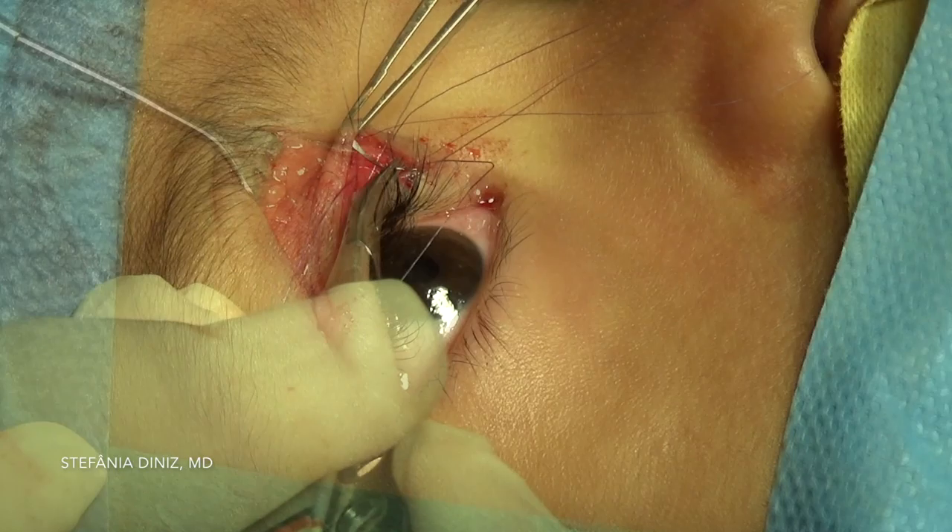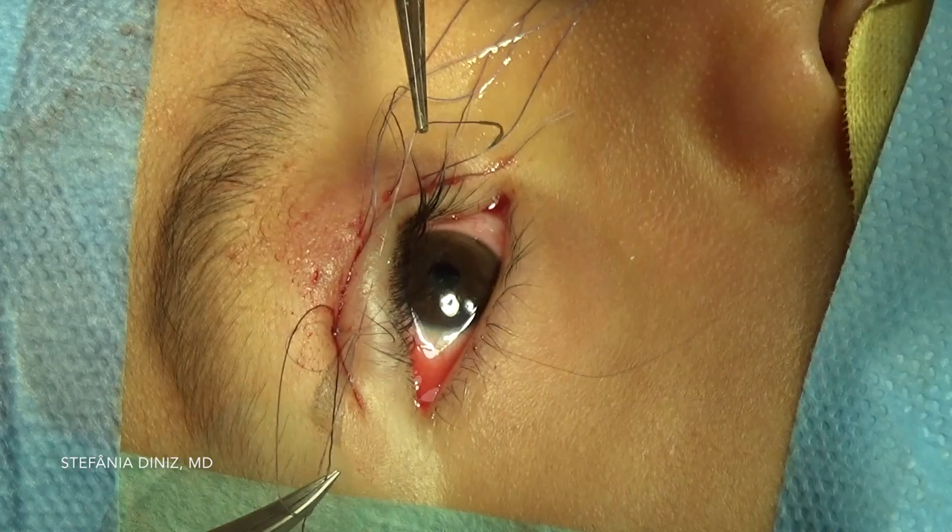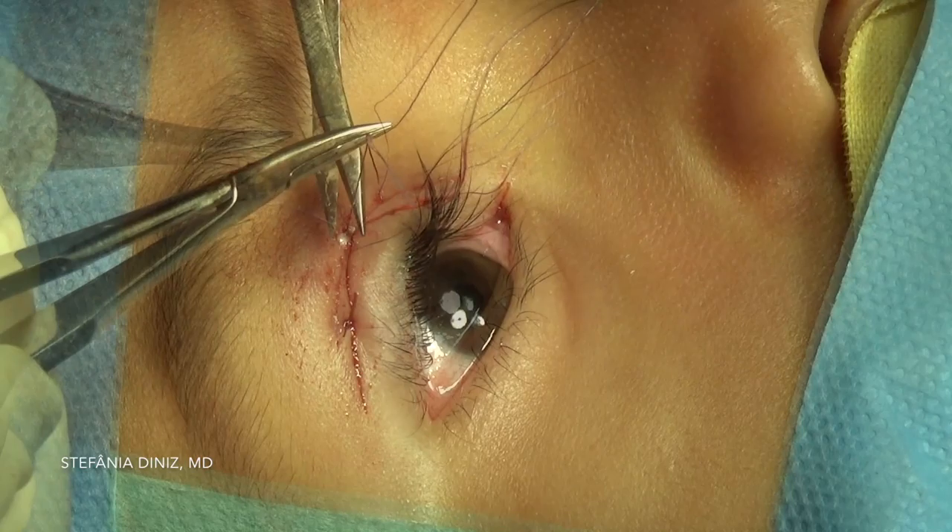Often, when a suture is placed, it will need to be left untied so that the adjacent suture can be placed. By the time sutures are tied, you can notice the resolution of eyelash ptosis.